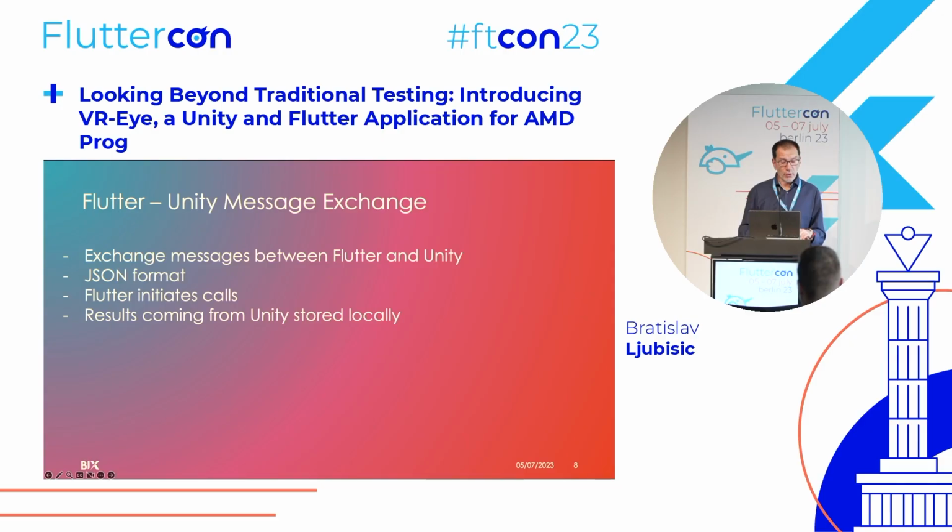So all of those results are stored locally on the device itself. We are not talking to a server, so the device is the only thing that's needed from the user. There is no need for an internet connection for the user. All the speech recognition and all the storing of the information are done on the device itself. So VOSK is a good option for that, because it's doing the speech recognition offline, and also Whisper is doing the speech recognition offline. You don't need to contact anywhere outside the application.